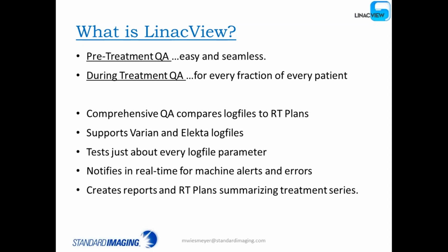It supports Varian and Elekta log files. Varian would be your Dynalogs and your trajectories, and Elekta would be at this point through the ICOM-VX interface. We are looking at other ways of doing the Elekta, which are higher resolution. The system tests just about every log file parameter, and I'll give you an idea what those parameters are shortly. There's a lot of things you can test, and a lot of things that might be of interest to a physicist trying to make sure that deliveries are done correctly and that your machines are working properly.